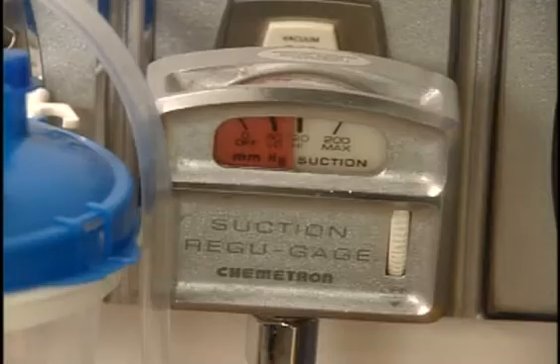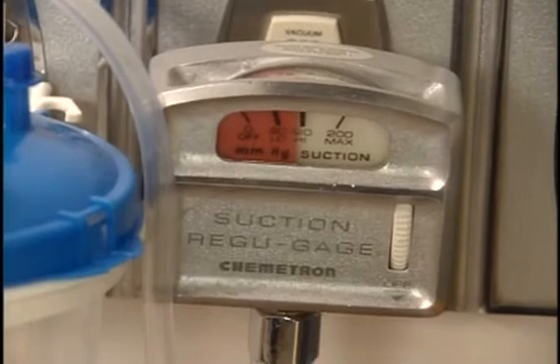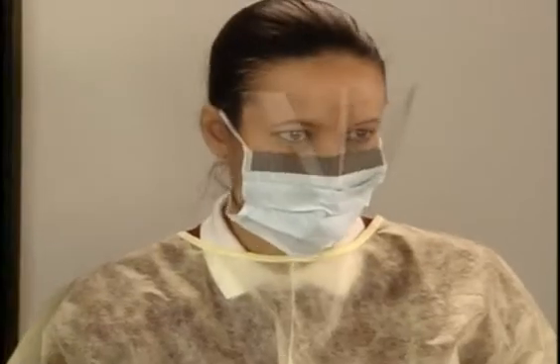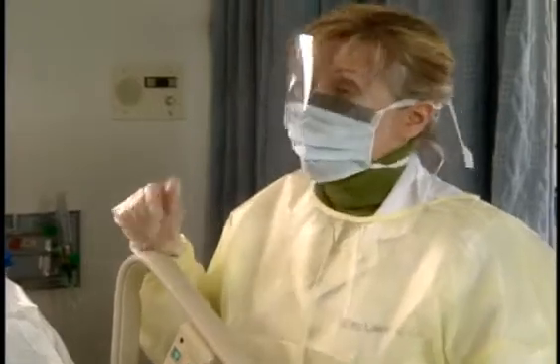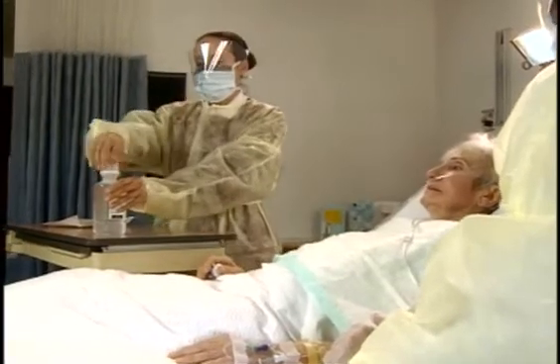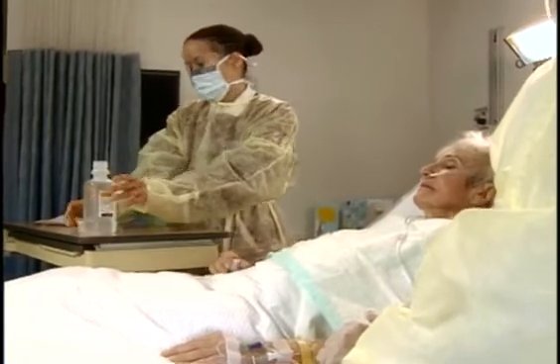The suction is on at 100 to 120 millimeters mercury of pressure since she's an adult. Okay, this is where I need some help. Sure, Anna. Well, the suction's on, so open the saline and then open the sterile suction catheter package and put on the sterile gloves.